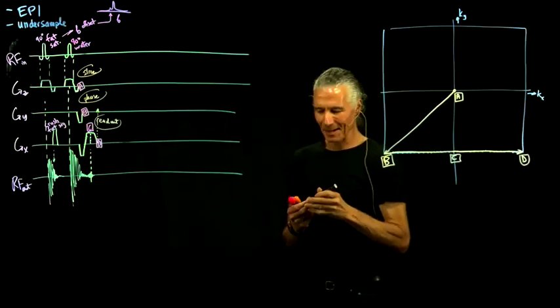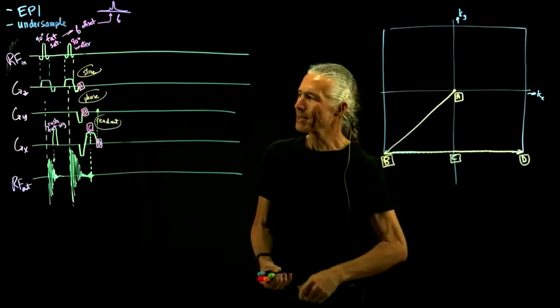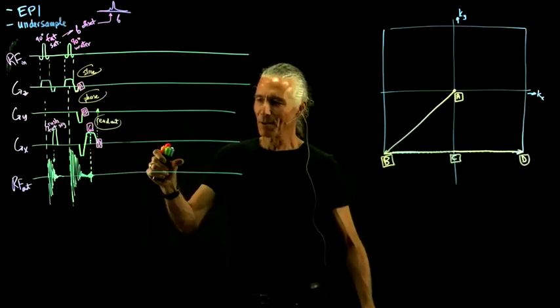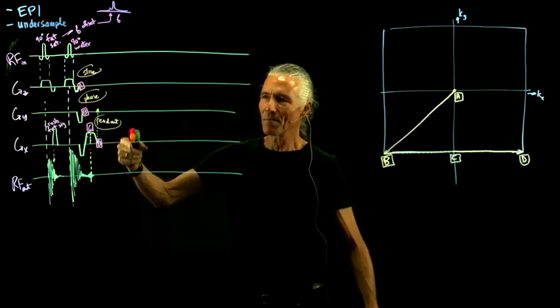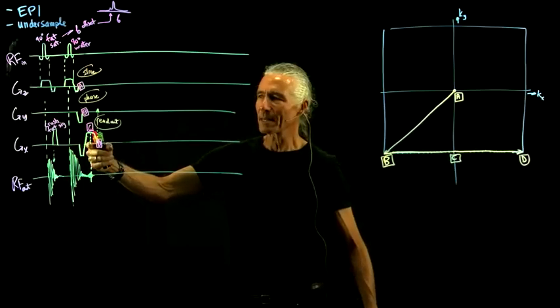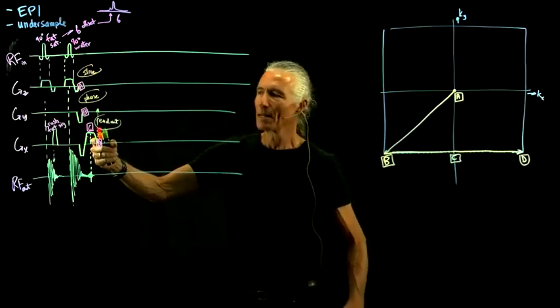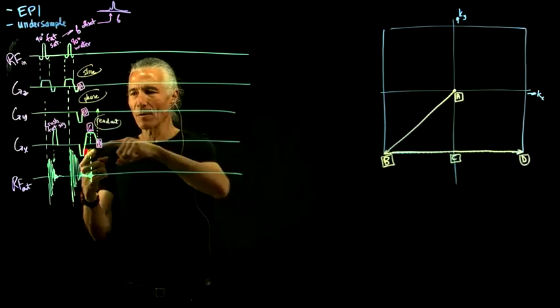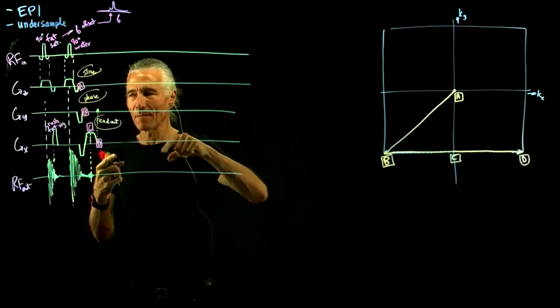Why do they call it a blip? If you listen to one of these sequences, what you hear is a beep, beep, beep. You hear this really high-pitched sound, like 1,000 hertz. The reason for that is this looks like a 1,000 hertz sine wave, going up and down 1,000 times a second.